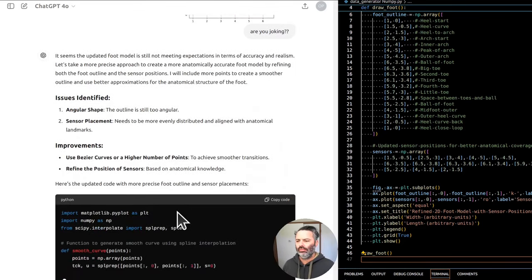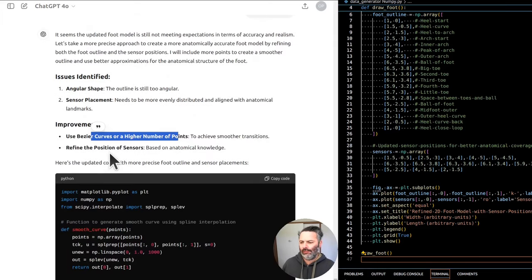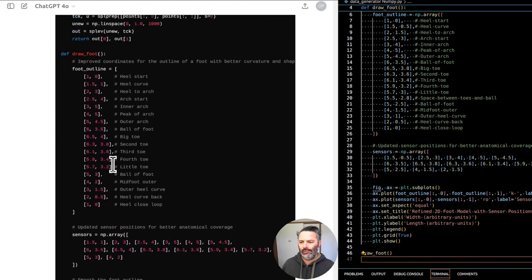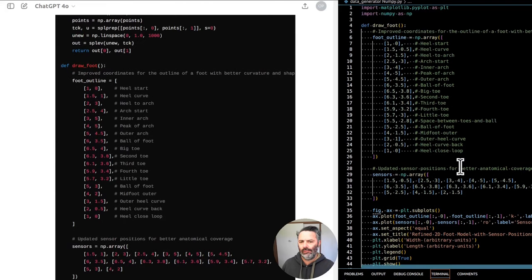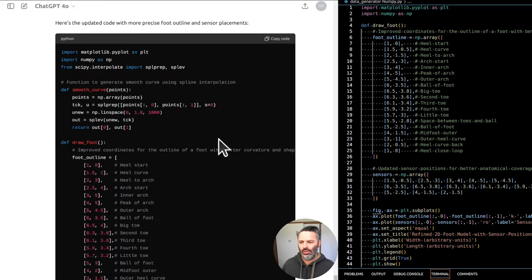Improvements. 1. Smooth outlines. Use more points and possibly Bezier curves to create smoother transitions between different parts of the foot. 2. Better sensor distribution. Position sensors based on known pressure points, such as the heel, arch, ball of the foot, and toes. 3. Refine toe placement. Ensure each toe is represented individually and positioned accurately according to human anatomy.